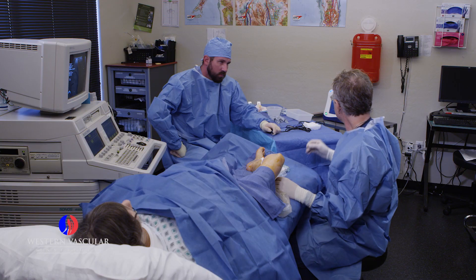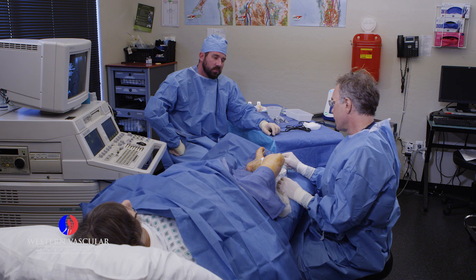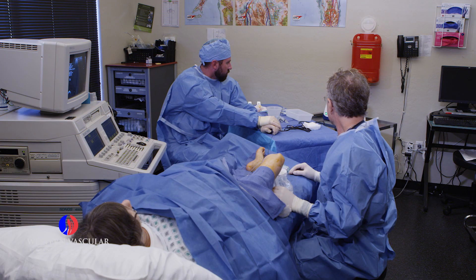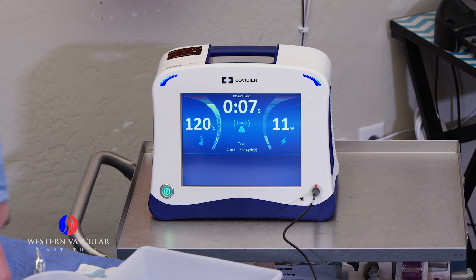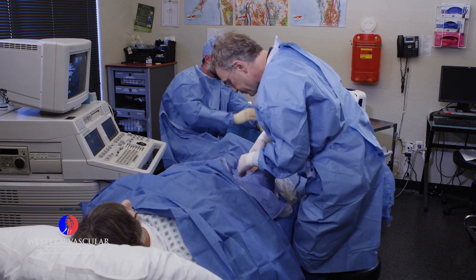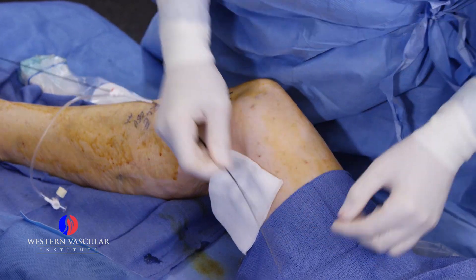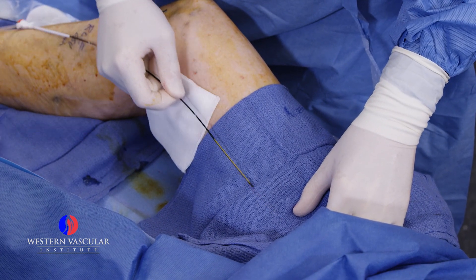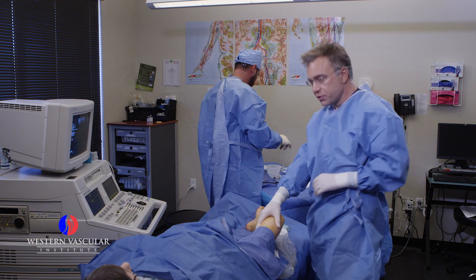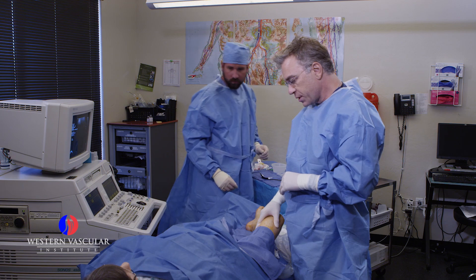We're burning the vein in 20-second intervals, advancing the catheter back toward the entry site between the hashes, pulling it back about five centimeters at a time. This is our last segment ablating the dilated saphenous vein, and we're removing the catheter now. There you see the heating element — that was the heat source, pulled back station by station at 20-second intervals until the saphenous vein is completely closed. We'll now apply a compression dressing, give post-operative instructions, and do a follow-up ultrasound to confirm closure and evaluate the patient in about three days.